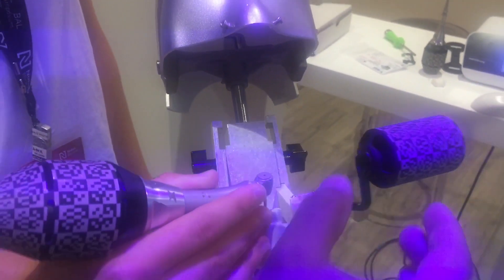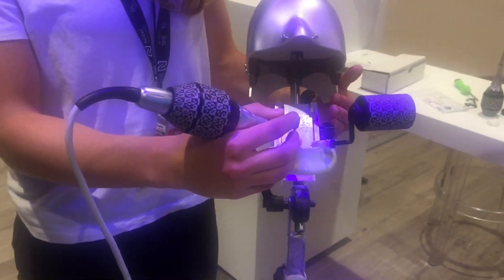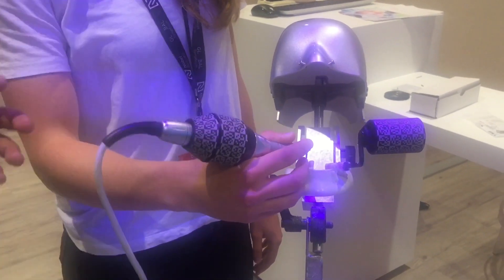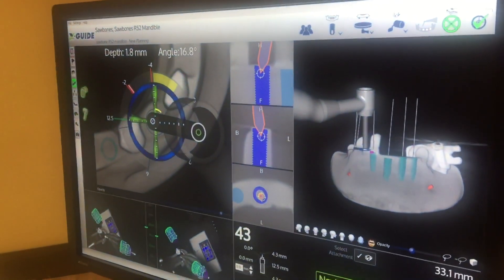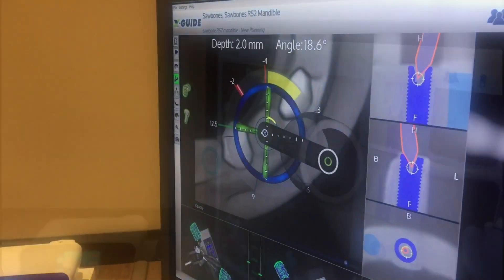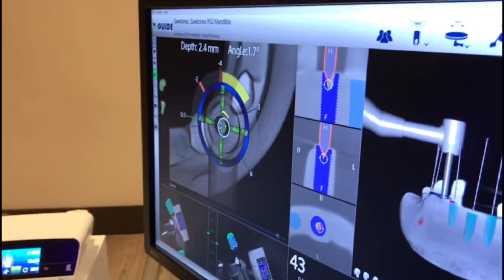You're going to place this X clip in the patient's mouth on the opposing side of the same arch, so that you have room for manipulation — to move around. The X mark right in the middle on the screen is where it's indicated. The X snap helps in placing or preparing for an implant site, all the way through to implant placement.